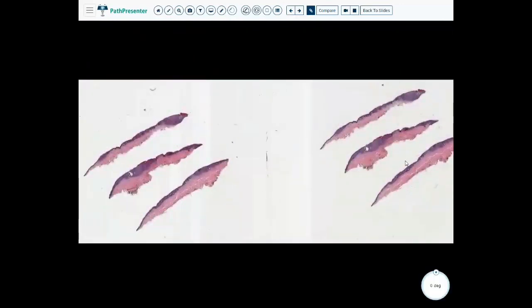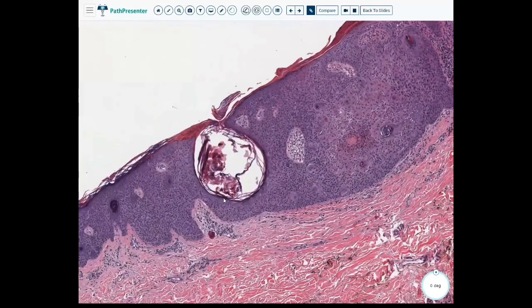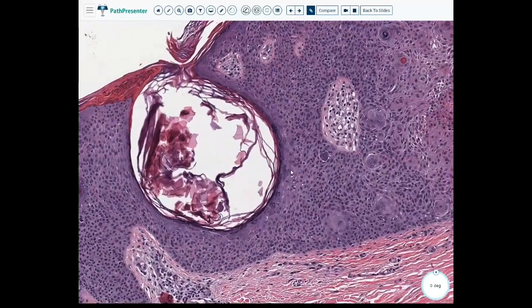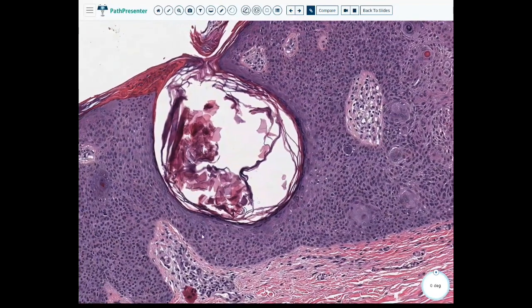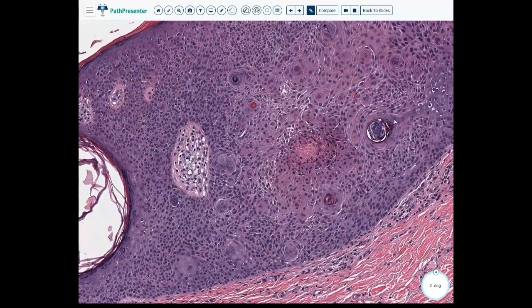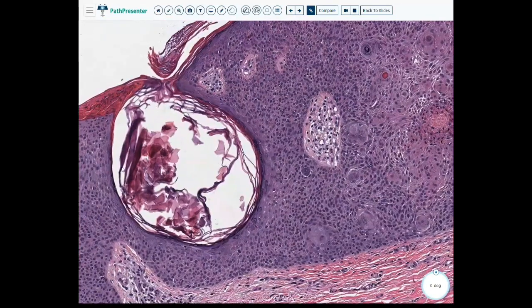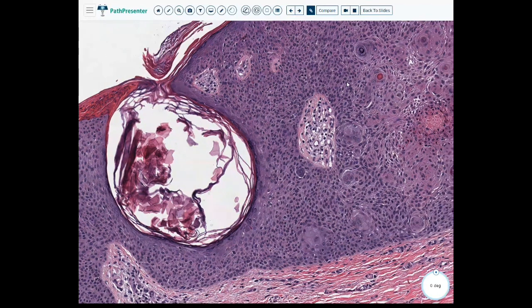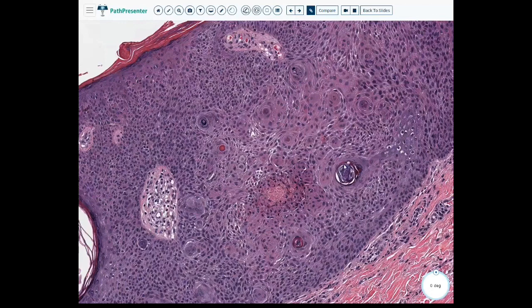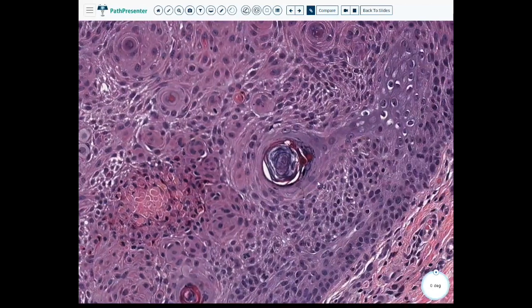Case two. We can already see part of our pathology — we definitely have some acanthosis of the epidermal layer, and the dermis, at least at this power, looks relatively sparing. The epidermal layer is relatively basophilic and we have these little things hanging out. This one technically fits because it's keratin, but what doesn't fit is that you can see where it opens up to the surface. This next one is much better — we have a cystic space with this onion-skinning type keratin. This is a pseudohorn cyst.